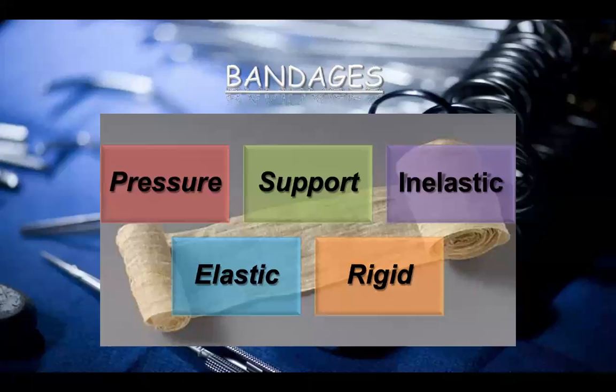What is the use of that? It is used to apply pressure over the wound. They are also used for support. They can be elastic, and they can also be rigid. These are the various characteristics of the bandage that has to be applied.